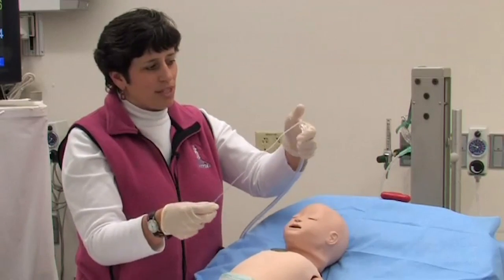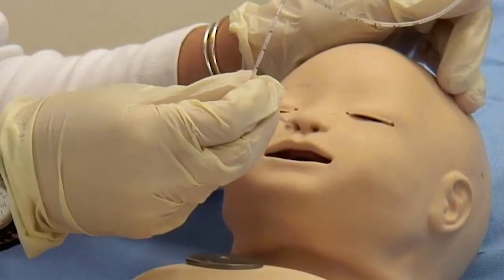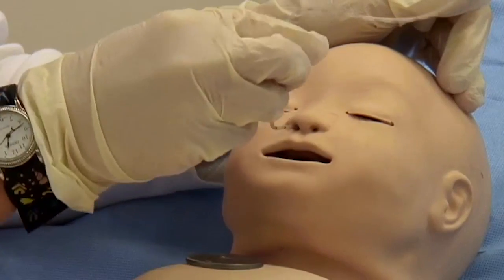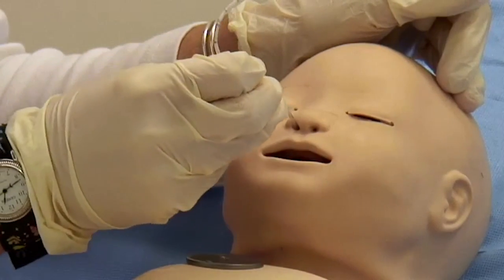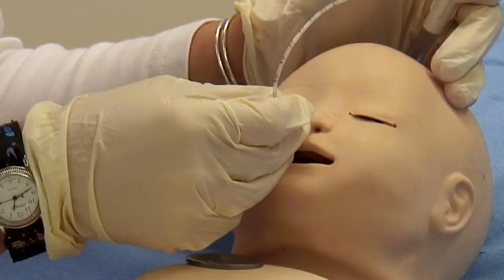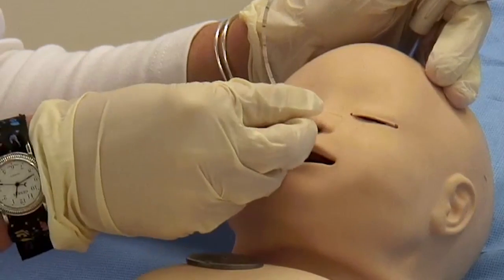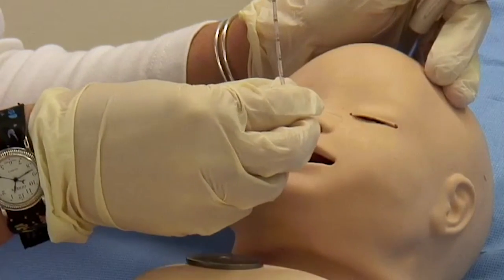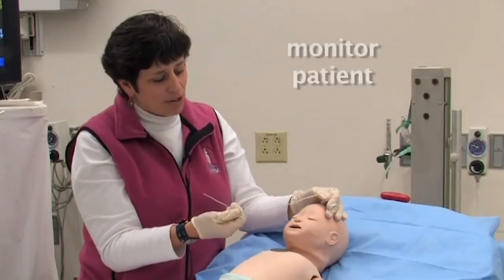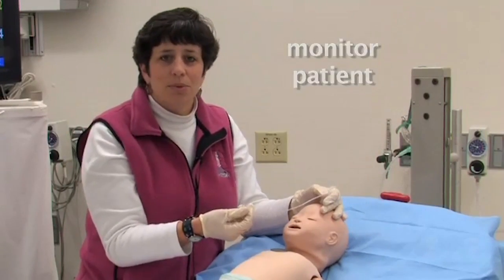I am going to go down one more time. Now I am going to apply suction. You can roll the catheter on the way out as well. I am going to examine the secretions and monitor my patient to see how they have responded to the procedure.